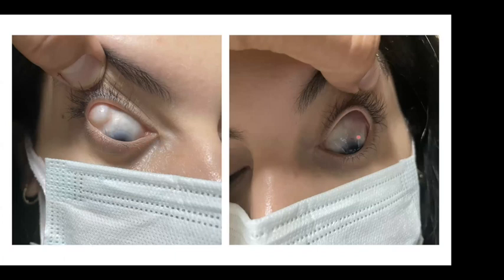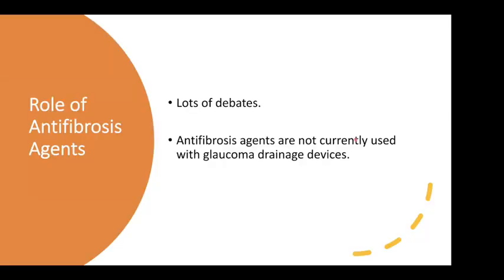She has very, very advanced field loss and she's sighted. But again, when you see that the valve is placed very posteriorly, cosmetically it is very, very acceptable to the patient. So I just tell them that the appearance usually is not very bad.